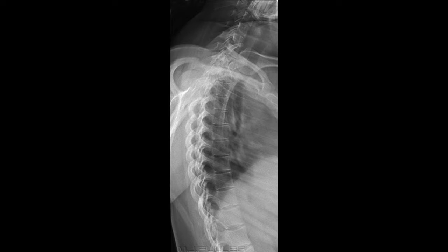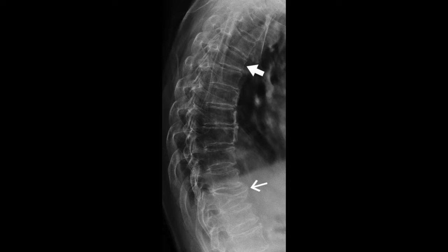The CR enters at the intervertebral disc base of C7 and T1 and MCP. The central ray is also angled 3 to 5 degrees caudal if the shoulders cannot be depressed properly for this image. The anatomical body plane was MCP for this lateral T-spine image.